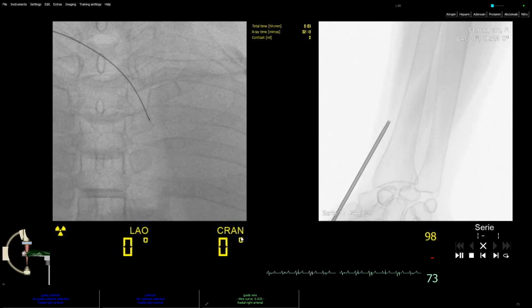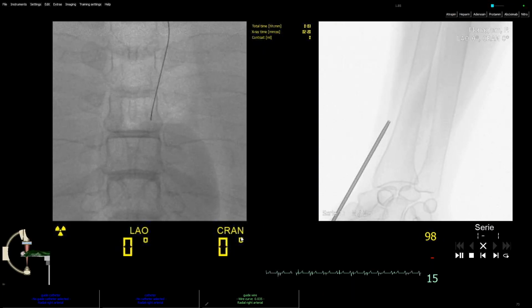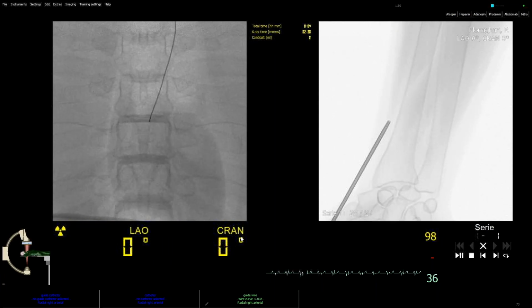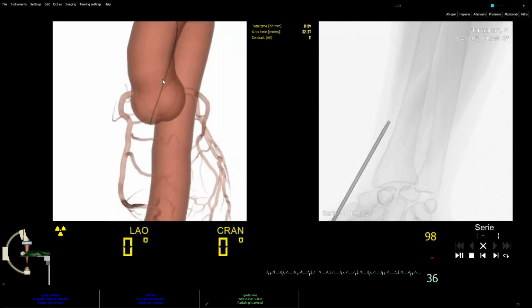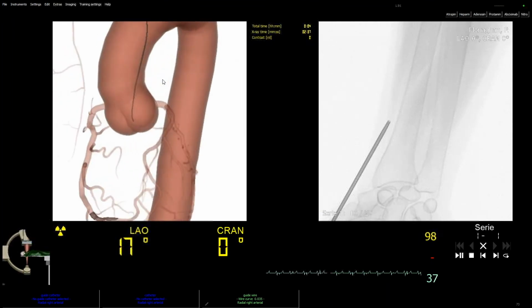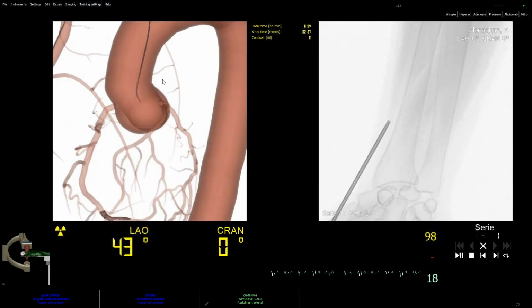You can see now the image is a quality image. As Dr. Carlos mentioned, it's taken from real cases. Also, Ahmed, we have here a 3D option, so that you can see the image more clearly. See now here. Okay, can you move, Ahmed, the C-arm, the LAO? Yes, exactly, more, up to 40. Yes. Okay.